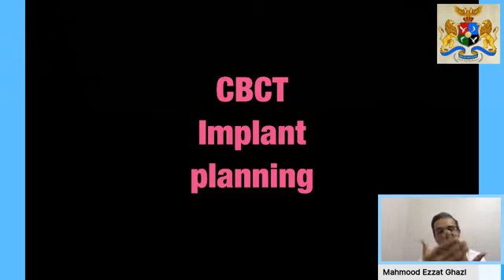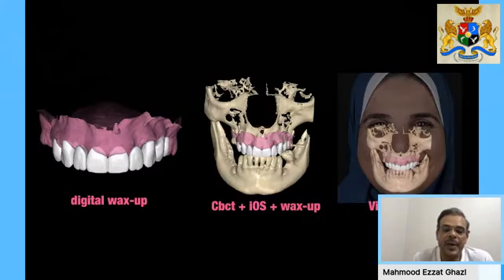Why? The photo is brought in first. The intraoral scan is registered or aligned to that photo. And then when I bring in the intraoral scan, it's brought in that same position once more. So it's a completion of the plan. Then the CBCT is brought in that same position once more. So it's a completion of the plan at the end. So when we bring in the CBCT, it's registered to the plan that we have already done. It's registered to the intraoral scan and the digital wax up.